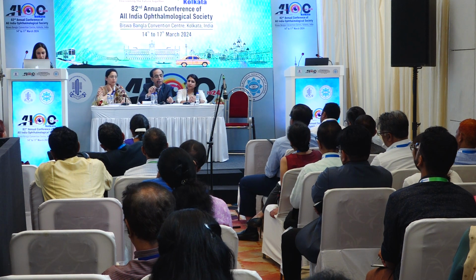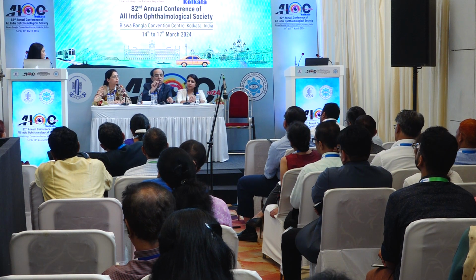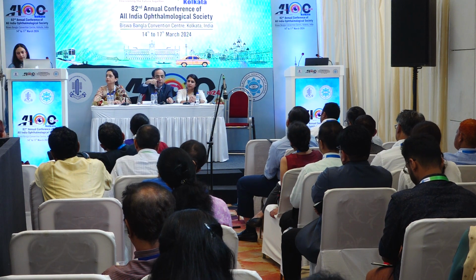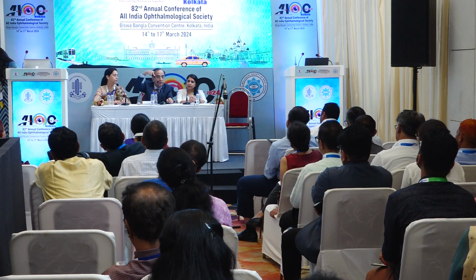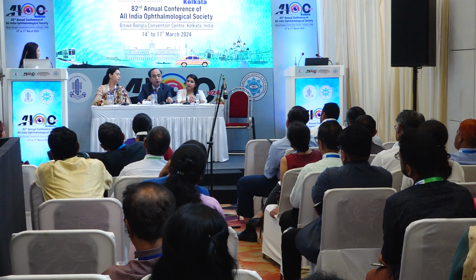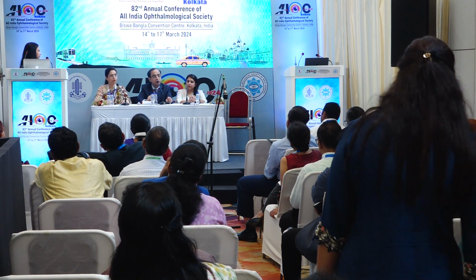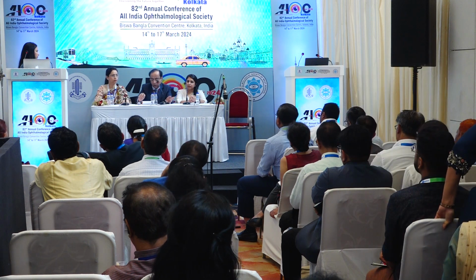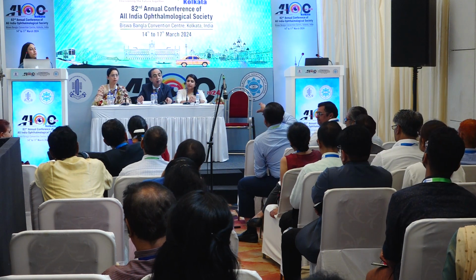And a 0 degree tip gets hold very fast. With a small material, you can hold it and you can build up the vacuum. But with 0 degree, because of the angulation, the lower part you are not able to see. So the universal tip now uses a 30 degree, which is the commonest and serves all the purposes. So all of us are now using 30 degree.